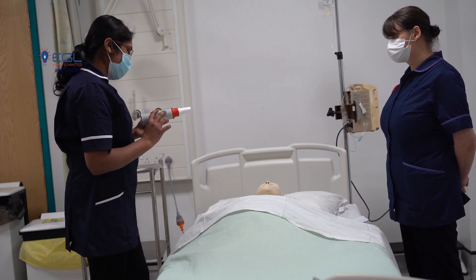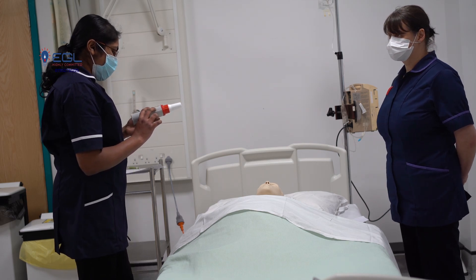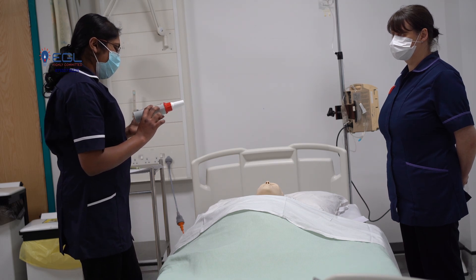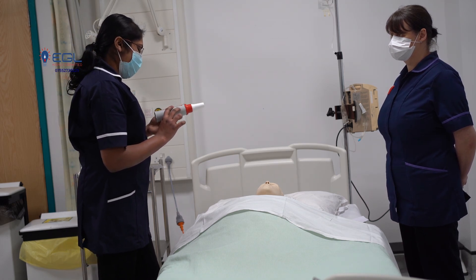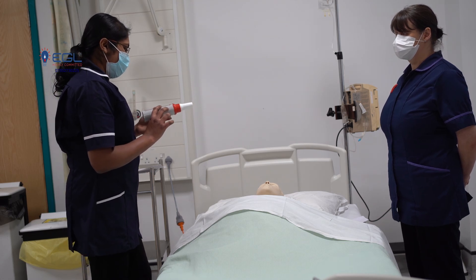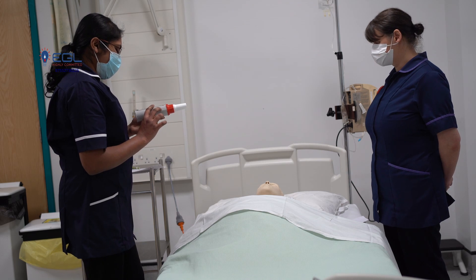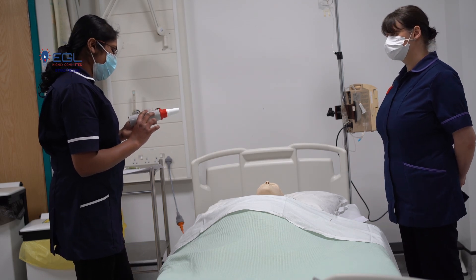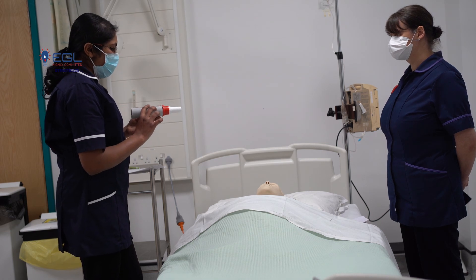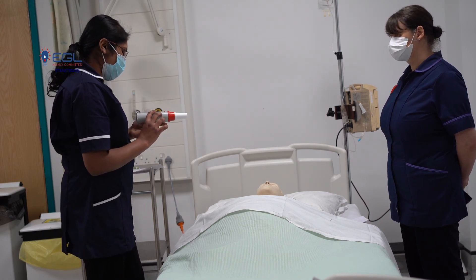Do you have any other concerns? No. Ensure the gauge is returned to zero before each attempt and take a deep breath through your mouth and hold it for no longer than two seconds. Will you be able to do that? I should be able to do that. After that, you need to seal your lips tightly around the mouthpiece and forcefully blow into the meter. I hope you understood.